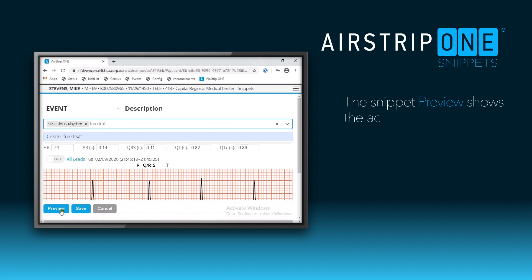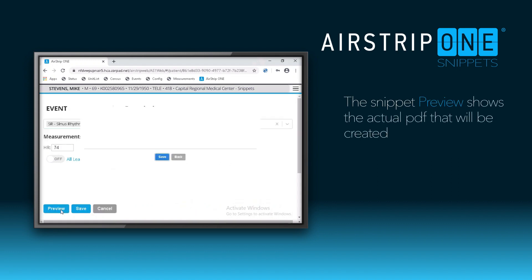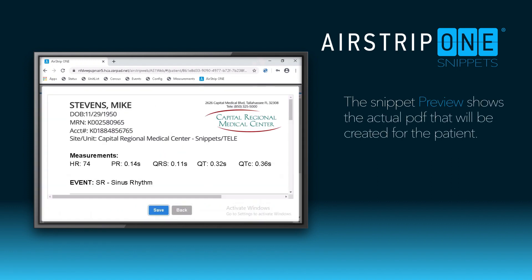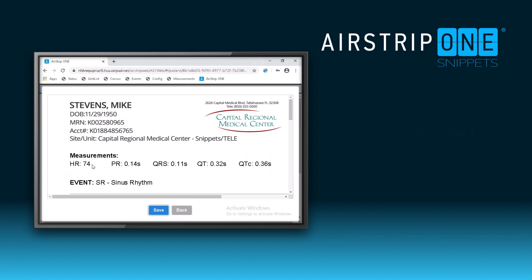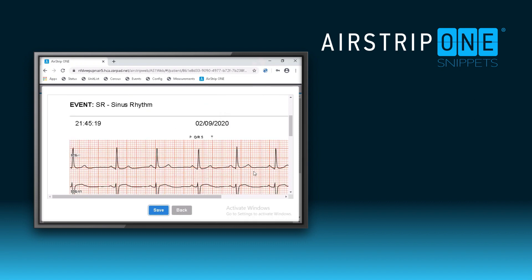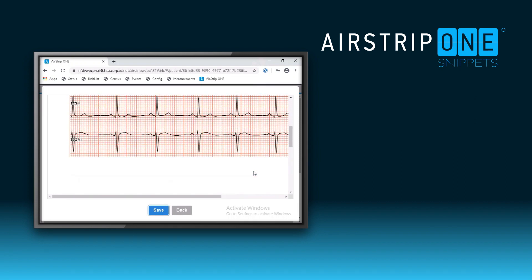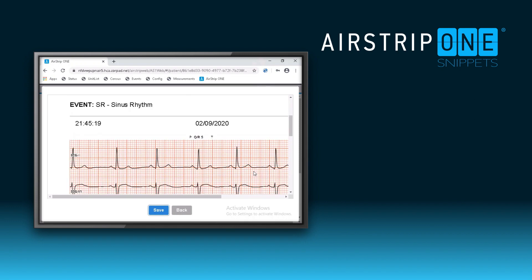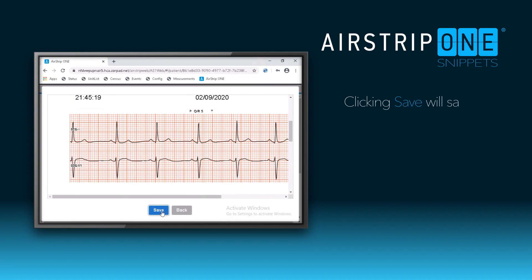You can also preview the snippet before it's saved. The snippet includes the patient's name, room number, information, and all of the measurements and the event. Clicking Save will save the snippet into the patient's EMR.